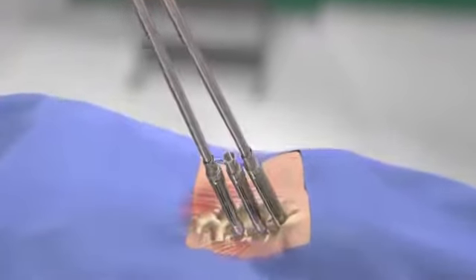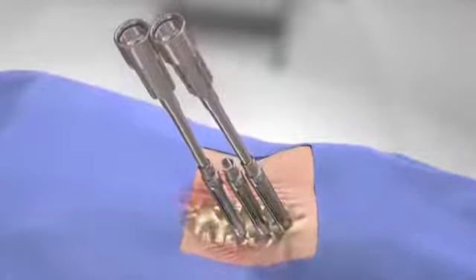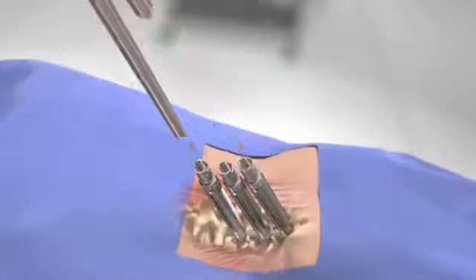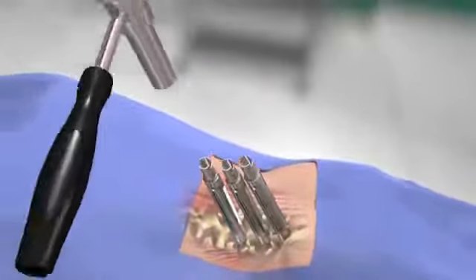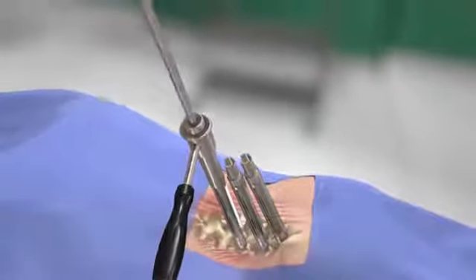After all set screws are in place, final tightening will occur by placing the counter torque over the top of the screw extensions and tightening the set screws with the final driver.